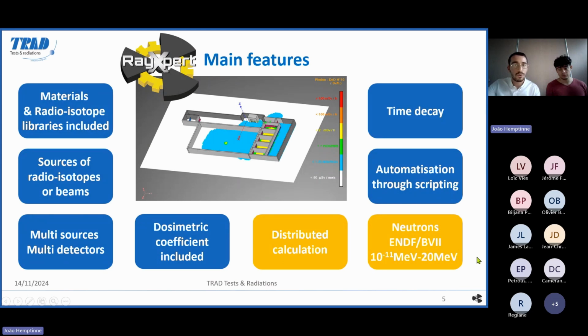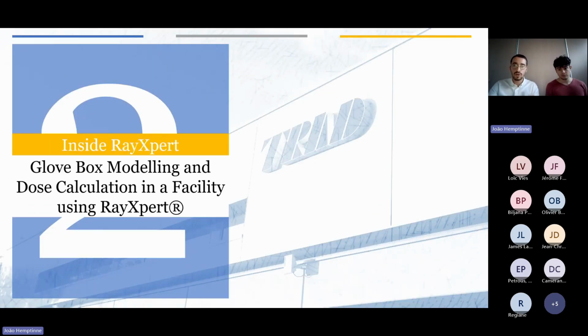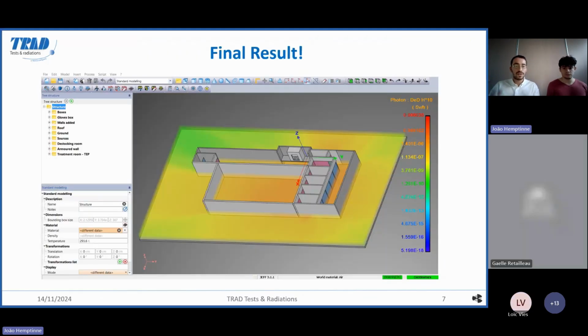This was a really quick introduction just to get you to know the software. Now we'll start with our model with Leo. Here is the final result we want to present today. We have a model that Leo will detail later, and you can see a dose mapping of the radiations, with a continuous color scale, the units, and the range of the values. Thanks to this mapping, we can design the walls and the shielding everywhere, choosing the materials and the thickness of the walls, so we have the shielding we want at the end.